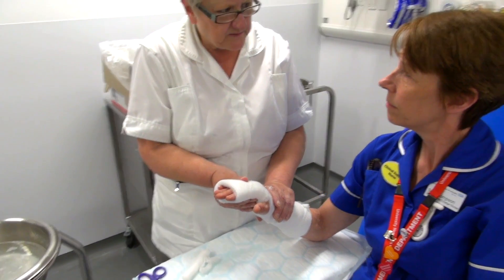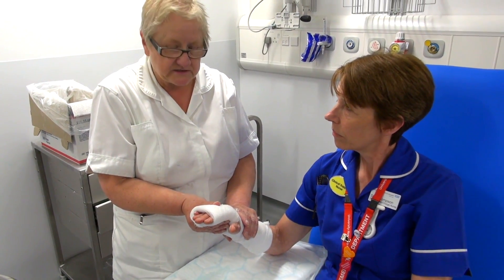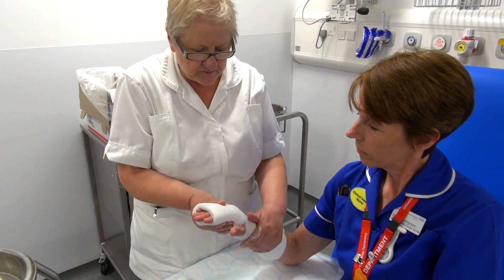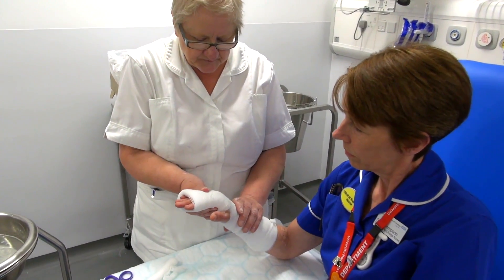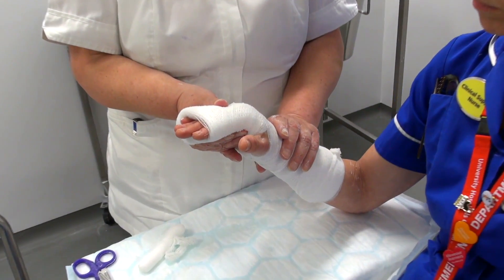This will be on for approximately six weeks. This plaster doesn't get changed. So you just refer it to Fracture Clinic as normal. But hopefully this is the only plaster they're going to have on. When you've done this, you need to put it in an high arm sling.